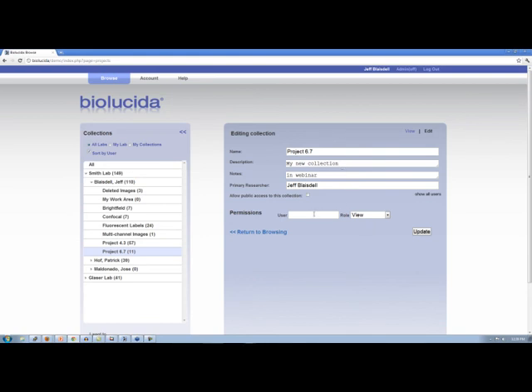But to add permissions, right down here at the bottom, we have a section that says permissions. What I'm going to do is I'm going to start typing in a username. Okay. And if you can see that, it auto-completes. So it knows that you're in the system, so it auto-completed your name. If you ever forget who's in the system, we have an option which will show all users, and these are the users we currently have in this demo system. So I entered in your name.